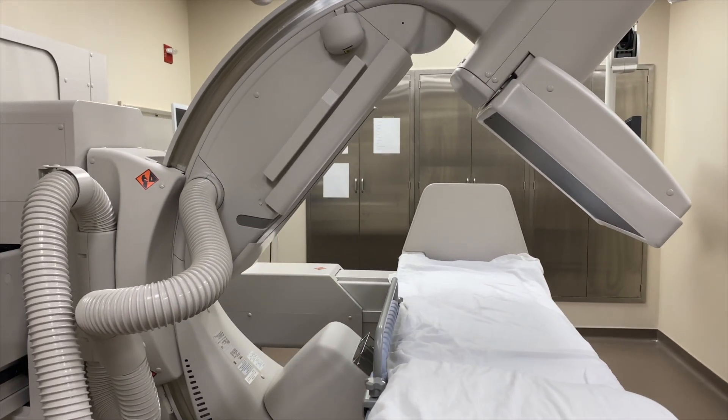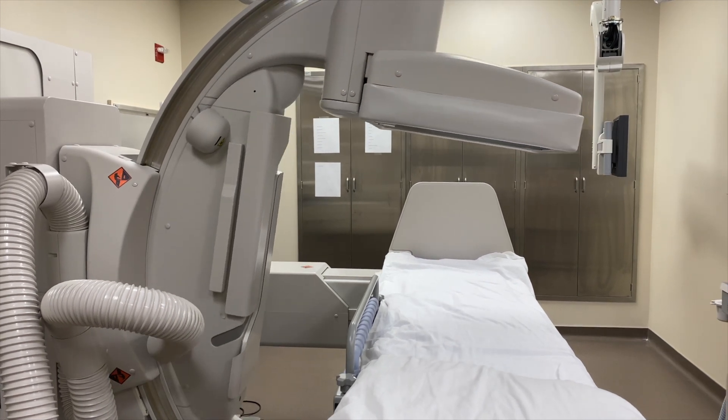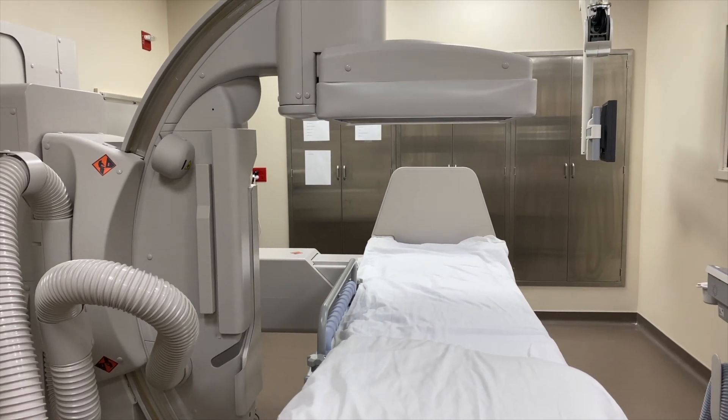We can do regular x-rays lying down on this machine with this tube, or we can also do them standing upright like at our normal x-ray room.